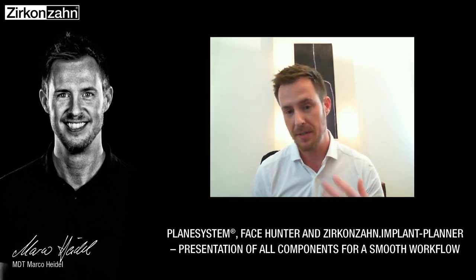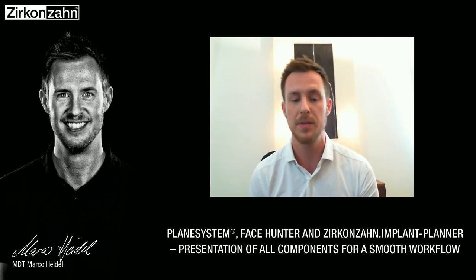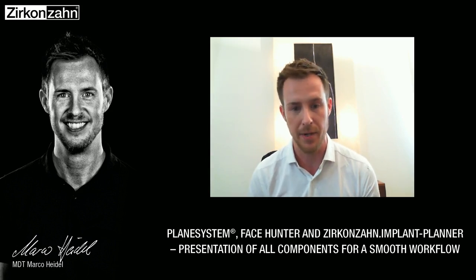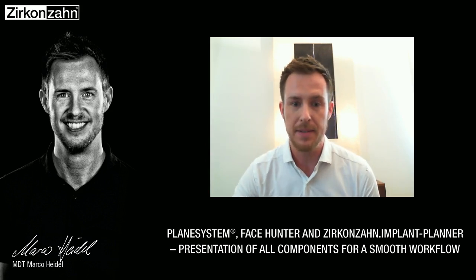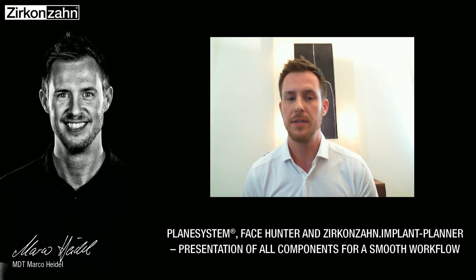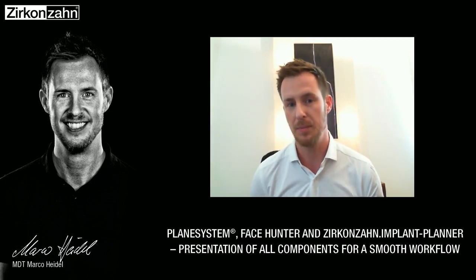During the presentation, you will also see Dr. Holger Meiser in a video. He will explain a little bit about the patient case we did together, and we want to present you the immediate loading workflow. But before we start, I want to give you some information about what we have new as materials.